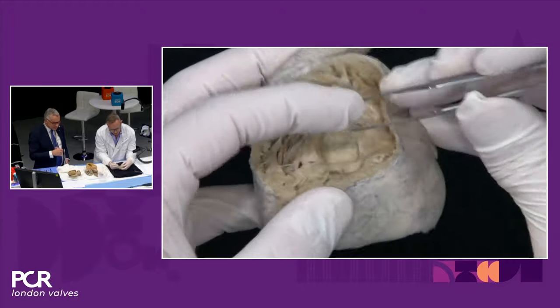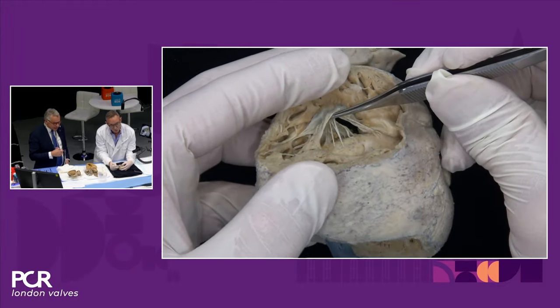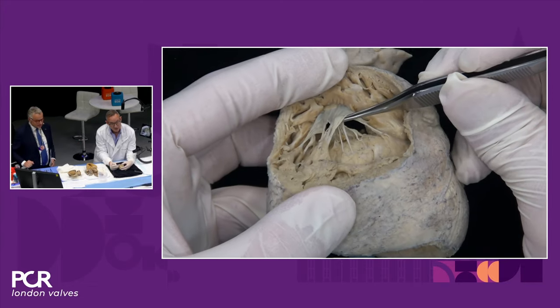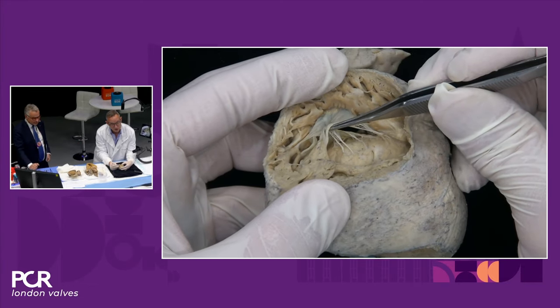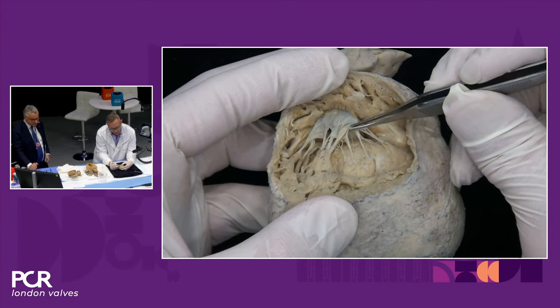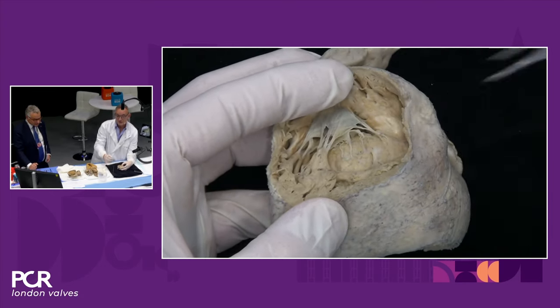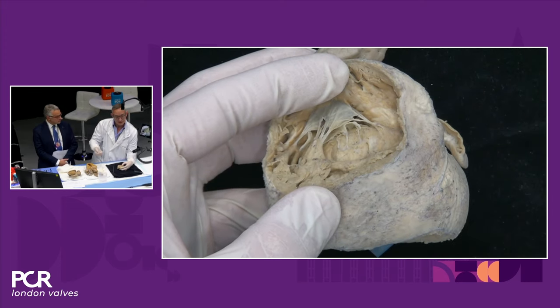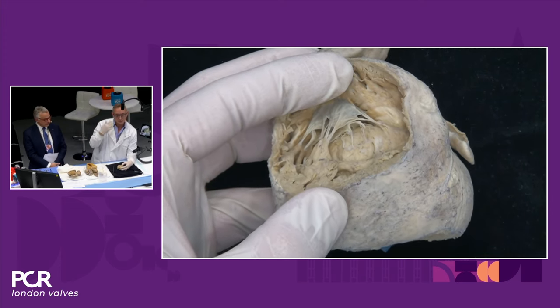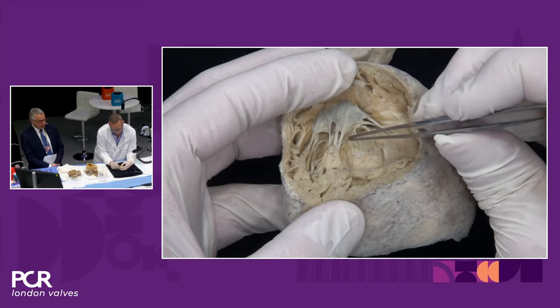Yeah. Let me turn it around again in your orientation. If I lift that up, and I'm sure you'll see this nicely on the simulator, there you can see the multiple cords. They're not just at the free edge, they're also what we call strut cords or secondary cords to the body of the underside of the leaflet. And that's the last leaflet to peel away from the myocardium and is quite variable in its attachment and its degree of delamination from the myocardium. And that is a bit our challenge.